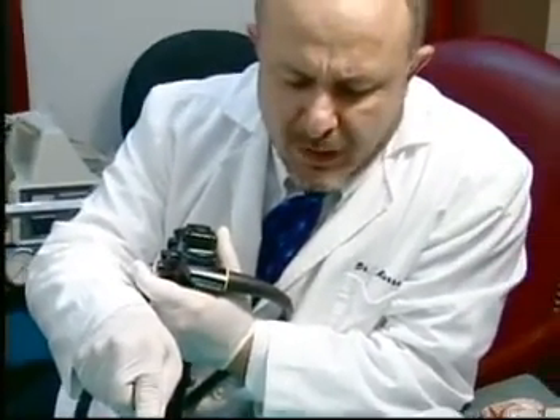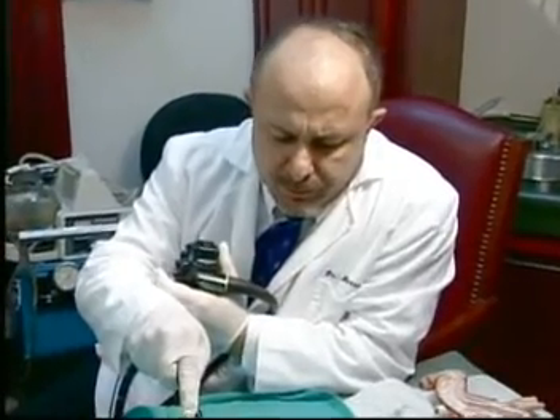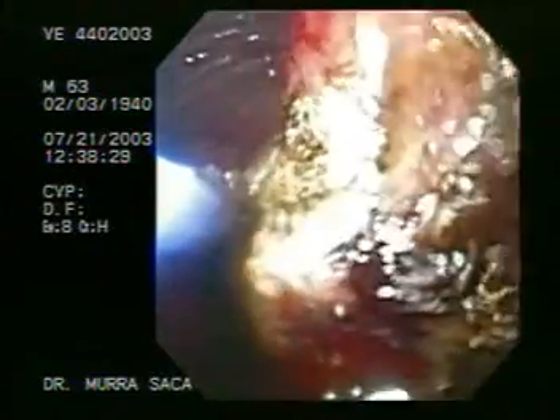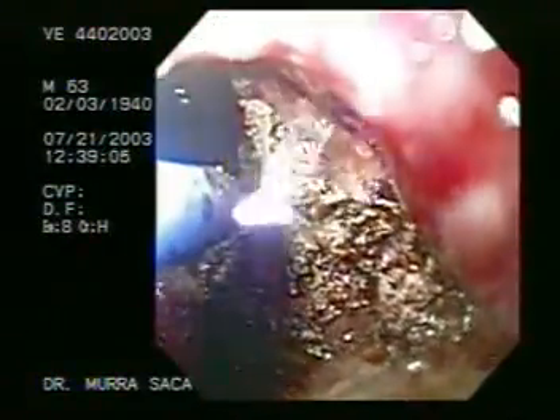All this has a wide range in modern therapy with argon laser. Through these equipments we can make multiple internal therapies, such as cutting the polyp and using it as a coagulator in an active bleeding. With these instruments we can save patients' lives in a few seconds.